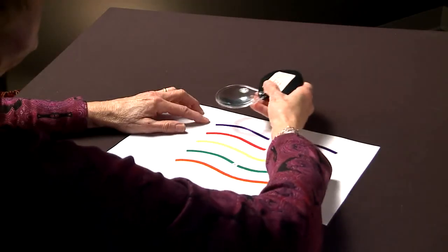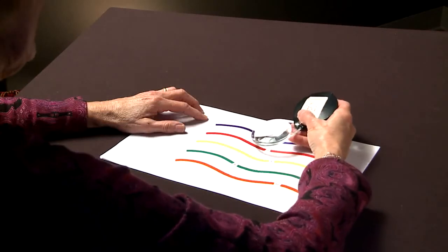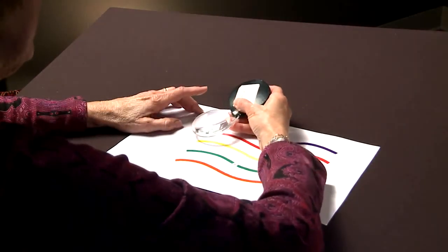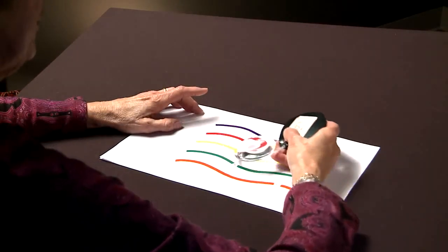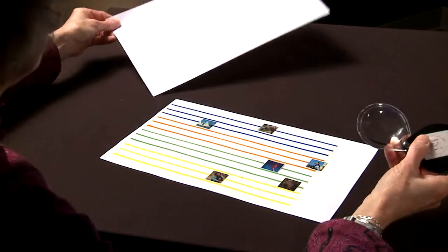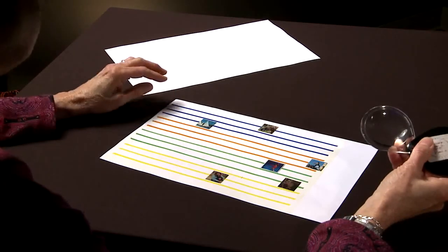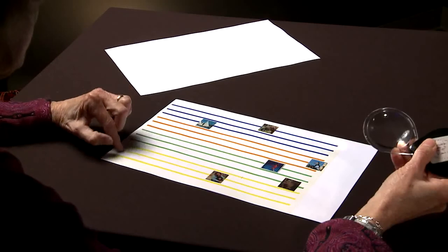So I may ask the student to follow the purple line and tell me what letter you see in the middle, and then go back to the left and follow the red line, etc. So we'll go all the way through this kind of little worksheet. Then, getting progressively a little more difficult, here's a similar worksheet. I have 3 blue lines, 3 orange, 3 green, and 3 yellow.